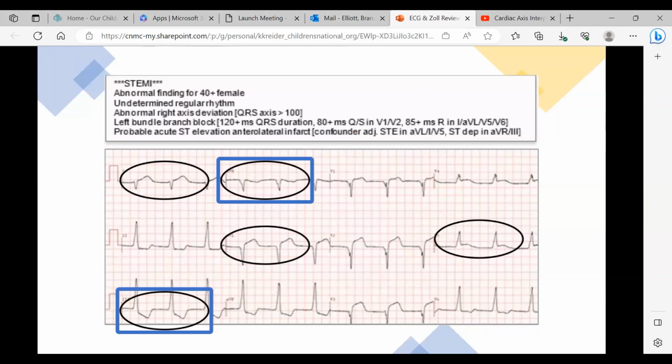But turning it down, so my very first deflection is going to be down. So the left bundle branch, but that's not normally consistent with the right axis deviation. So this is an abnormal EKG, which you'll very rarely see. Point is that you can note the ST elevation is prominent throughout, and you have reciprocal changes where it needs to be.